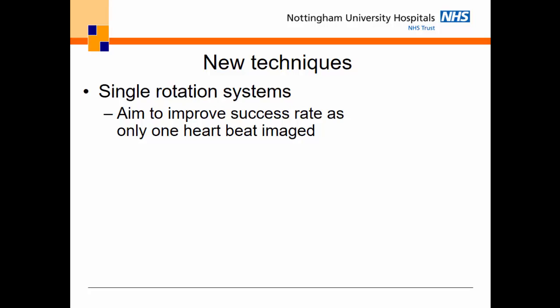So the point about these single rotation systems is you get the whole thing in one shot, it goes beep, and you're finished. No variations in amount of contrast. Do you know what I mean? No edges between the different sections that you've scanned.